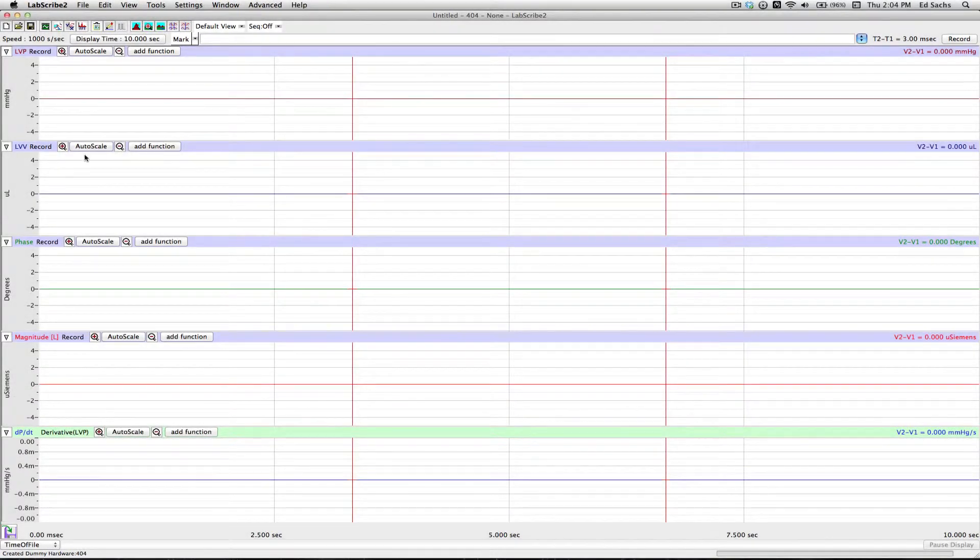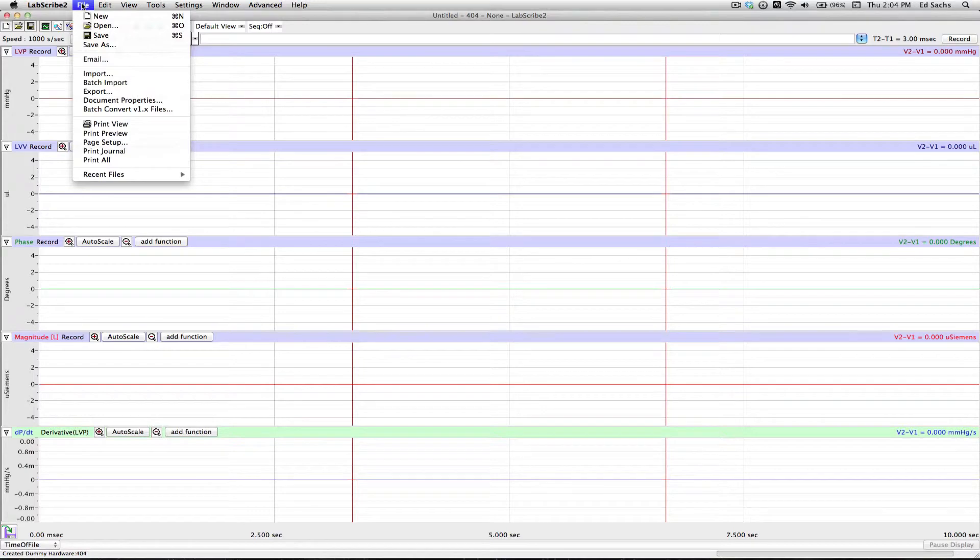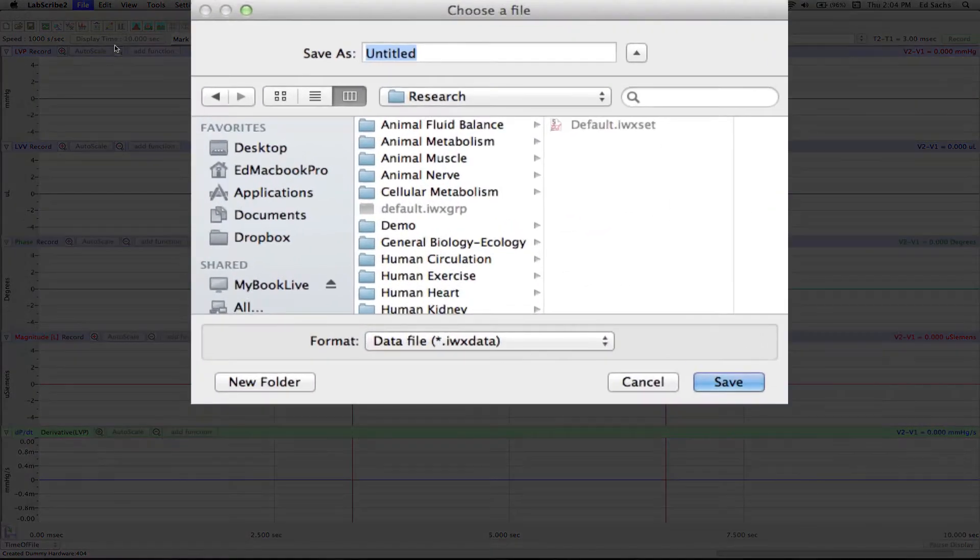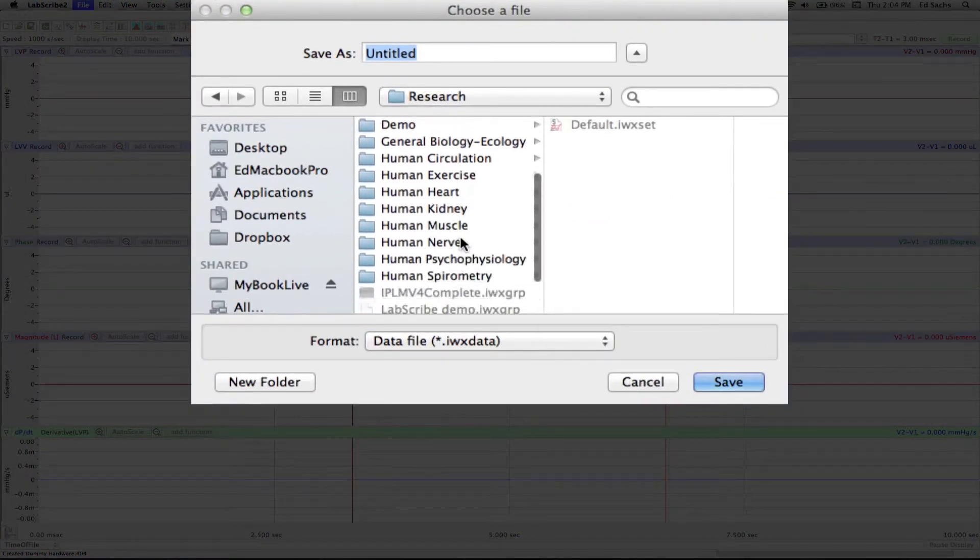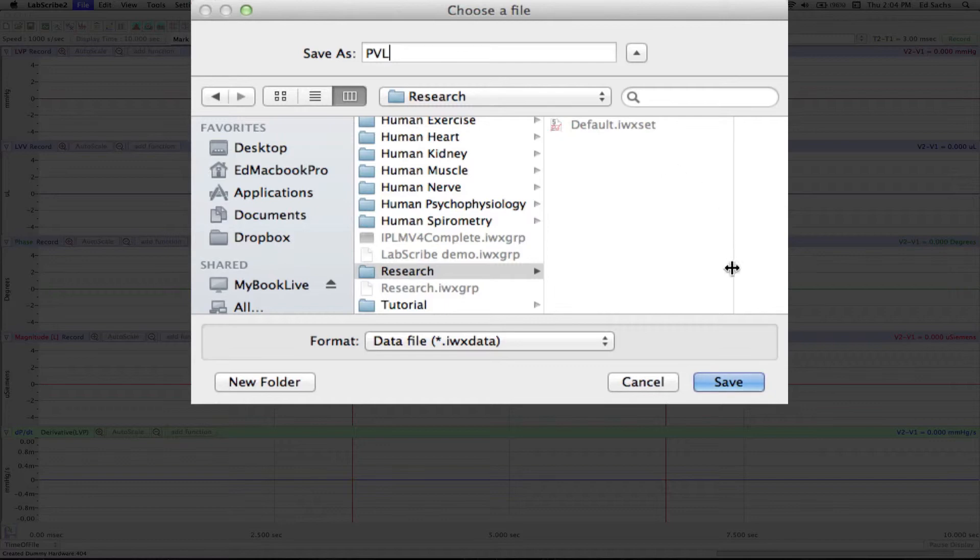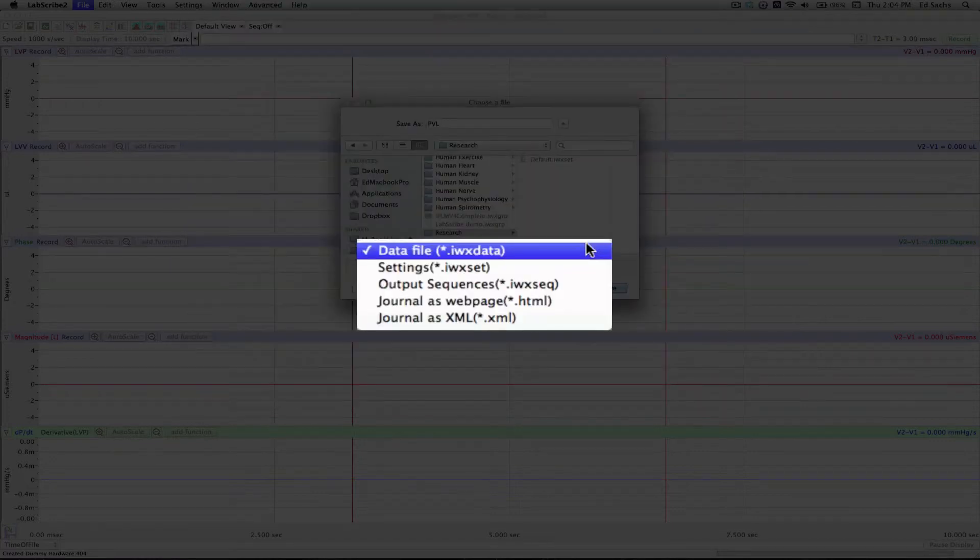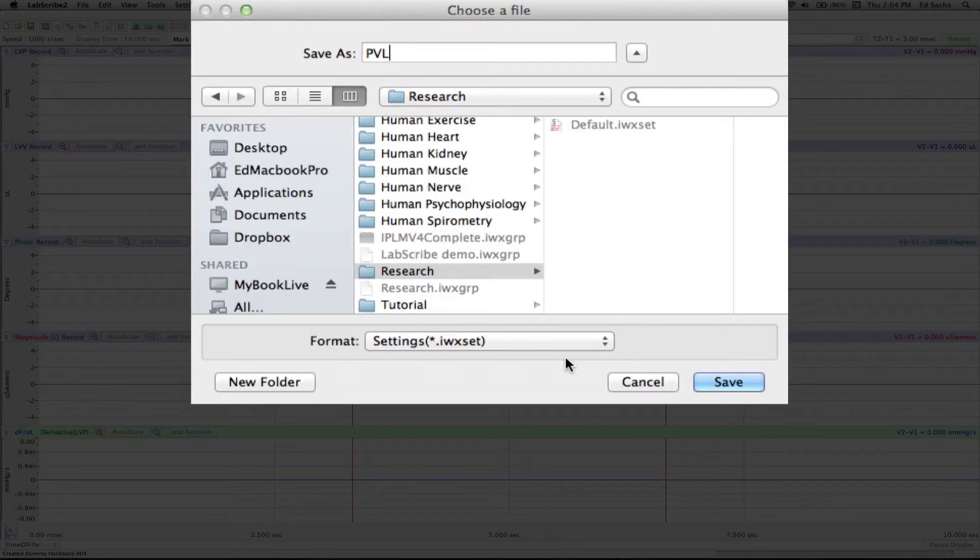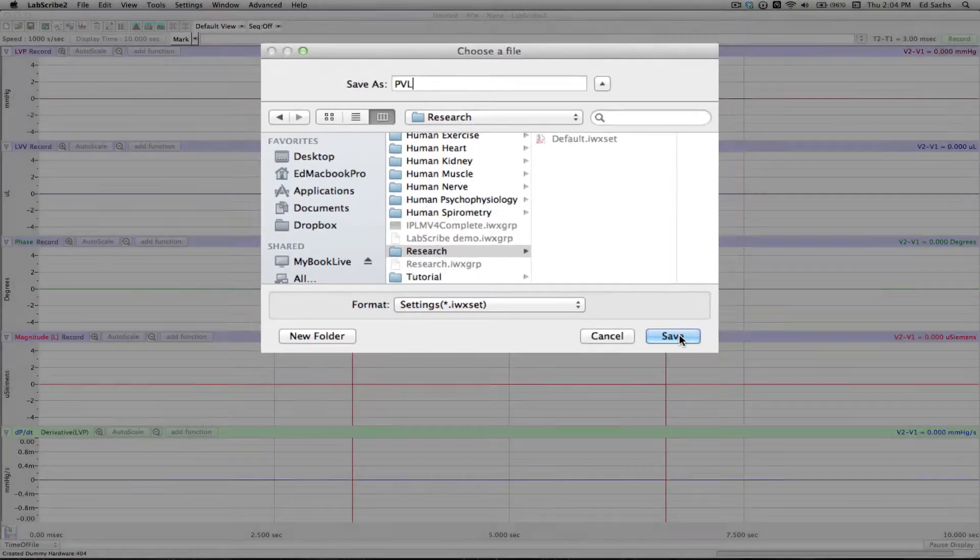Now we're ready to save. Go to File, Save As. I'm going to put it in my Research folder and name it PVL. Before I save, let's make sure it's a Settings file. I hit Save.